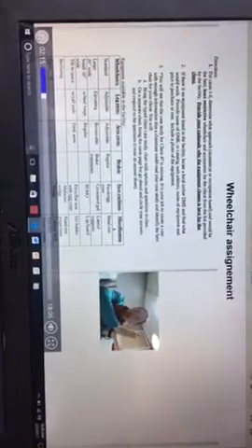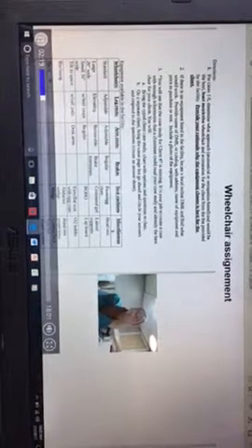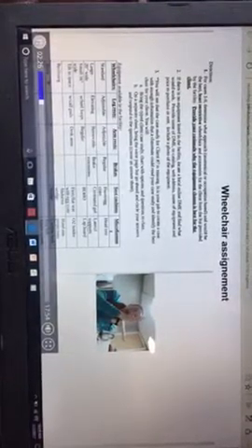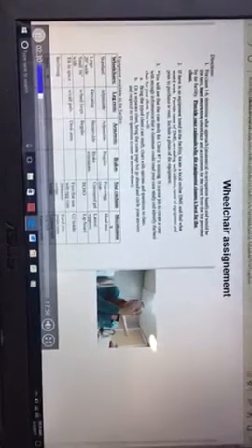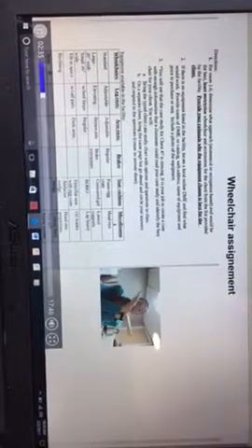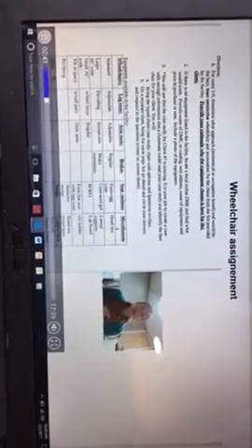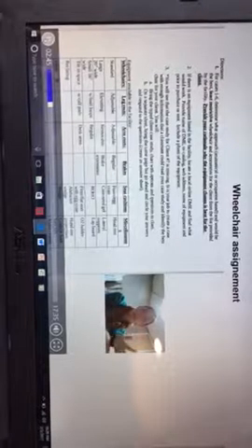A recline is basically where the back just moves. So the back will open or close. You can tilt the person back, but your seat pan stays still. And it either takes it from a 90-degree angle to more than that, like 110, 120, 130, or even, if you got them laying down, 180. So that's the difference between a recline and a tilt-in-space that goes all the way back. So keep that in mind as you're thinking. A tilt-in-space would be used for pressure relief, fatigue management.